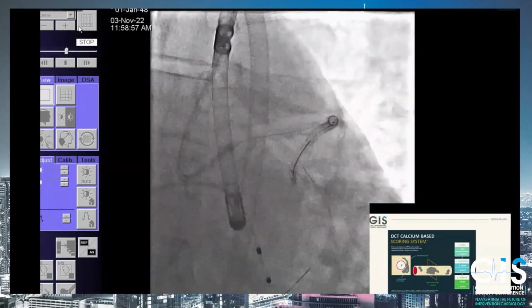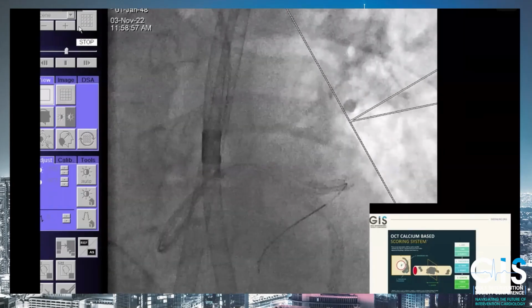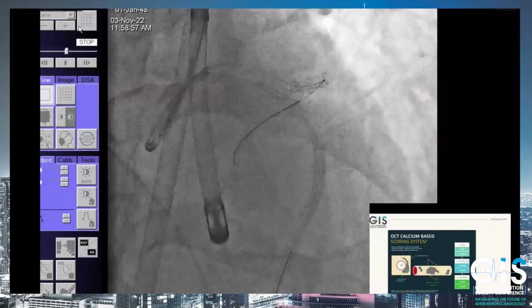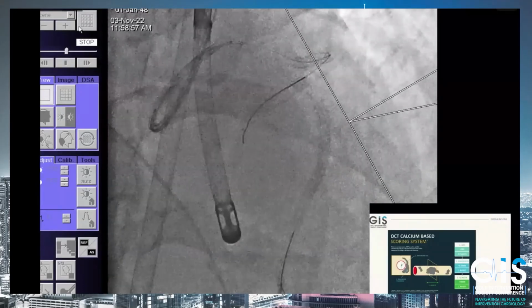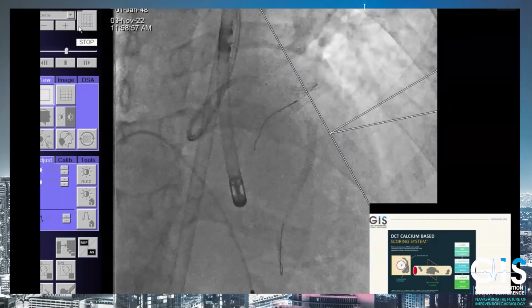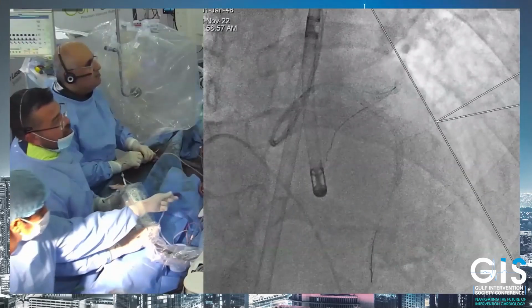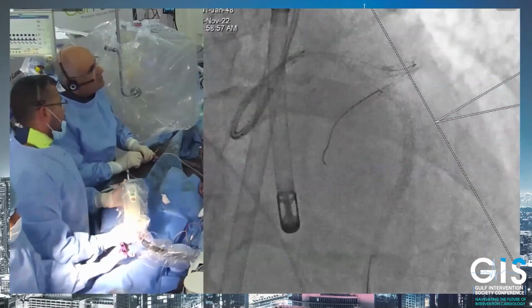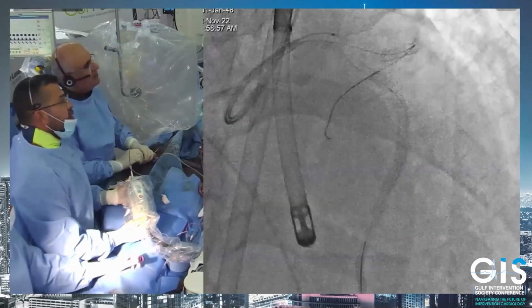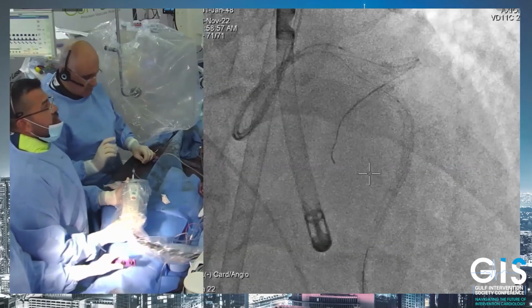Go to PA cranial, please. What was the balloon Arif used? Actually, may I comment on this? Our patient today, we are using a RenalGuard system, and we saw that using OCT in this lesion would give us a better idea about the mechanism of treatment of the calcium, either with only atherectomy or IVL plus atherectomy.